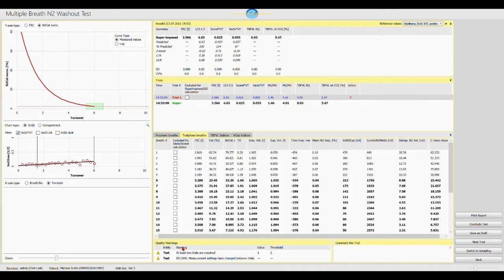The most important parameters of the washout are the functional residual capacity, FRC, and the lung clearance index, LCI, which are displayed in the summary section. After completion of the washout, you can print a report of the results.